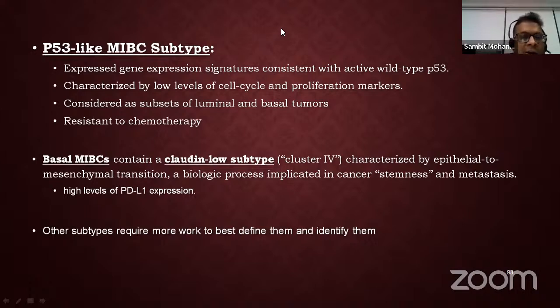Yes, if you see a lot of crushing, you mention that in the report. Sometimes in a very crushed tumor, you may not find good lamina propria or good muscularis propria. Sometimes it is even difficult to say whether it is high grade or low grade. So in that case, immediate TURBT doesn't help. They probably have to wait for 2 to 4 weeks, or at least a month, to go for a repeat TURBT. That should be discussed with the urologist and in the report. Unless you write it down in the comment section, you are going to lose the patient.